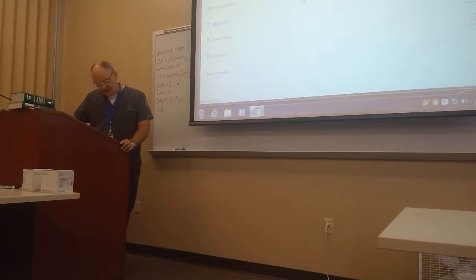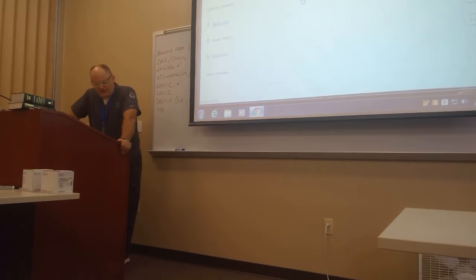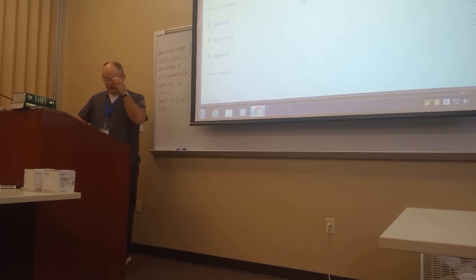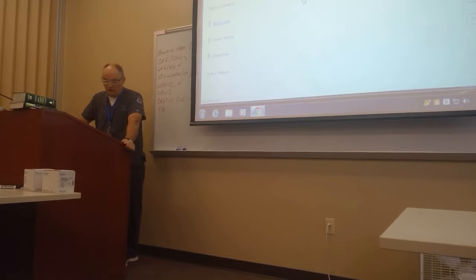Okay, page 16. I just want to refer you to that blue box up at the top that says criteria for urine specimen rejection. These are things that would cause you in the urinalysis laboratory to not accept a specimen to do testing on. The first one, of course, an unlabeled container. This happens a lot, more than you think, with urinalysis specimens.